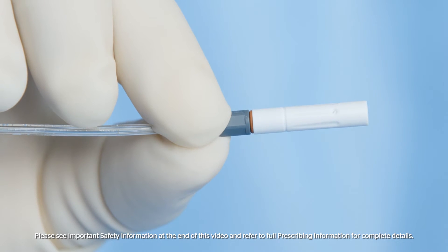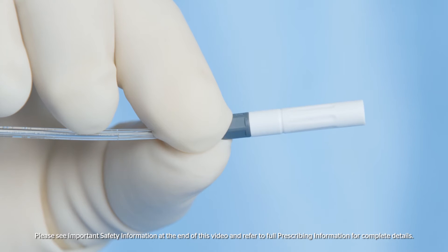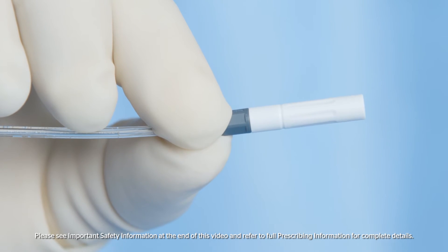Ensure the airless spray tip is securely tightened. The red indicator will not be visible if the airless spray tip is securely tightened.